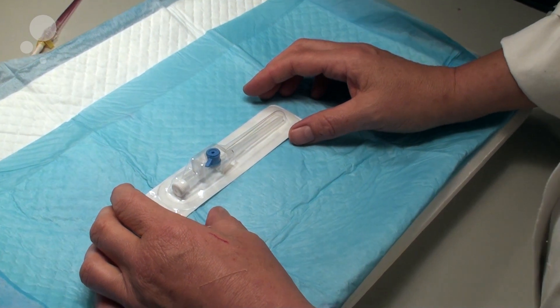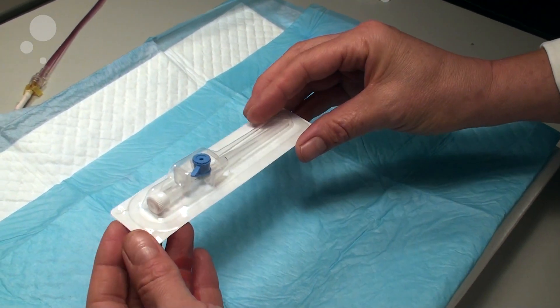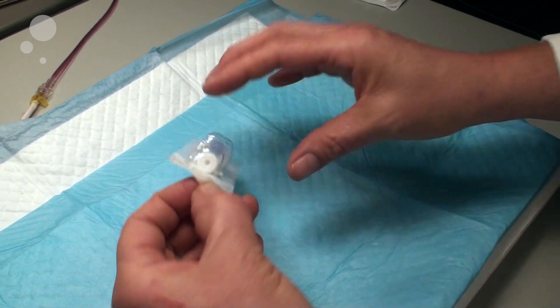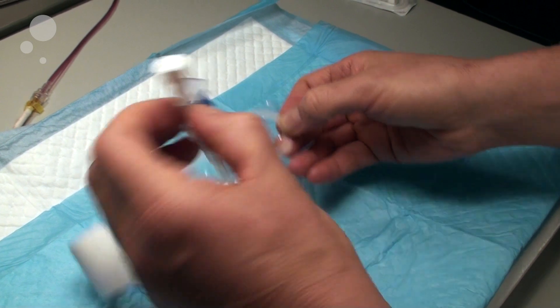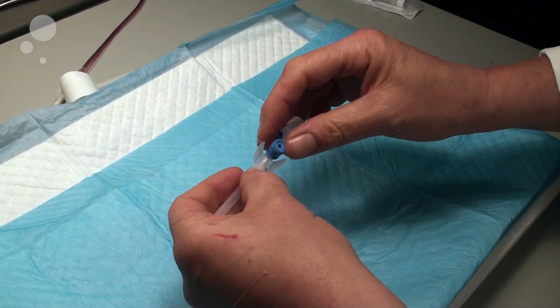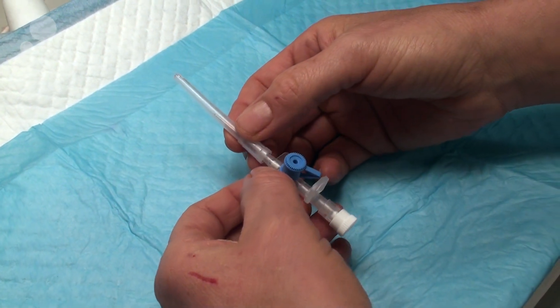When doing a tail vein catheter in rats, you could use a Venflon like this. It's basically a catheter with a guide needle inside it. I would suggest that you make yourself acquainted with the equipment before you start working on the animals.